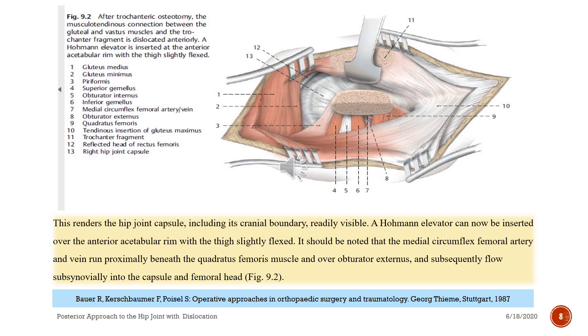This renders the hip joint capsule, including the cranial boundary, readily visible. A Hohmann elevator can now be inserted over the anterior acetabular rim with the thigh slightly flexed. It should be noted that the medial circumflex femoral artery runs proximally beneath the quadratus femoris muscle and over the obturator externus, subsequently flowing subsynovially into the capsule and femoral head — see figure nine-two.